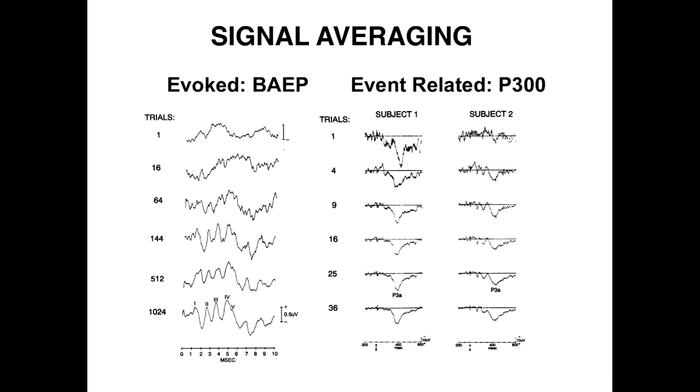So here's a real-world example. This is you when you were a baby, and you got one electrode on your vertex, and we're stimulating to record your brainstem auditory evoked potential, which we'll talk about more when we talk about coma. In fact, to call someone brain dead, their brainstem evoked potential has to also be gone in addition to their EEG being flat.